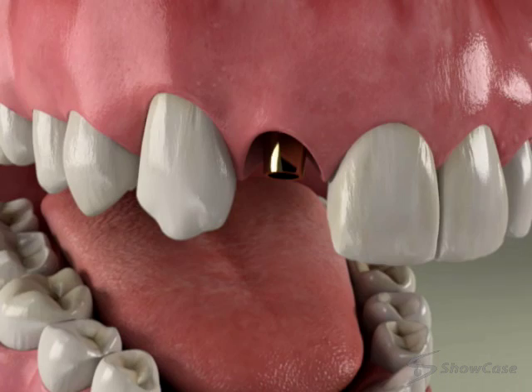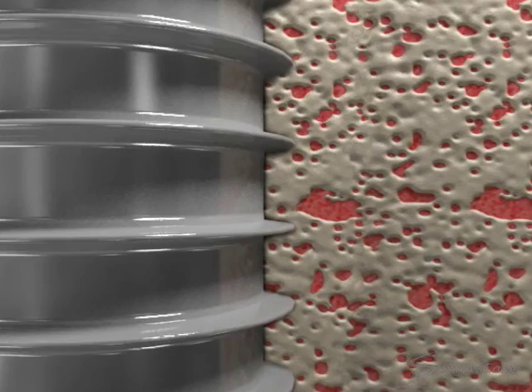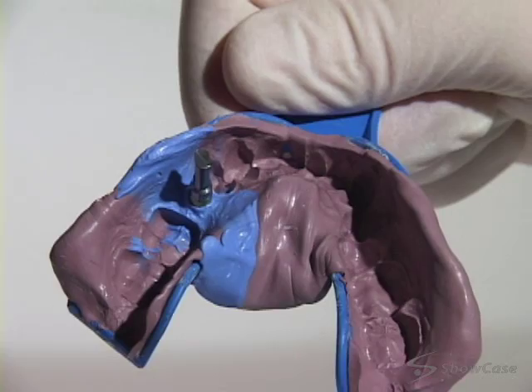Over the next several months, the implant will become securely fused to the bone. The next phase includes a series of appointments to fabricate your final restoration. Situations vary, but they usually include removing the temporary and making impressions of your mouth. The lab uses the impressions to make an accurate model of your mouth, including the implant.